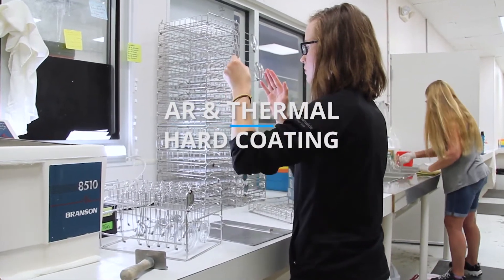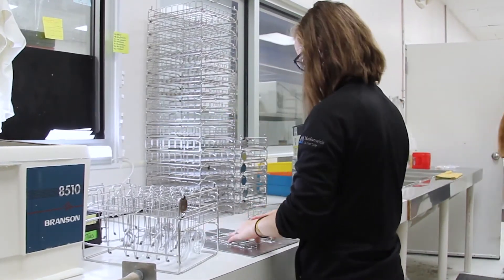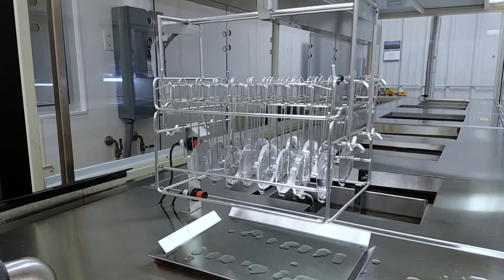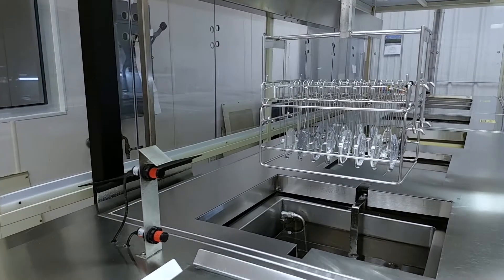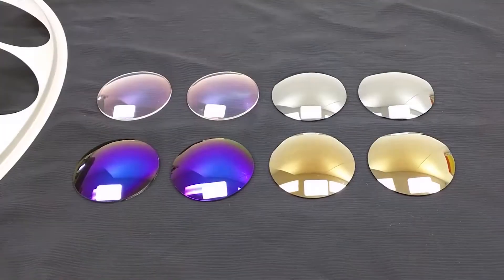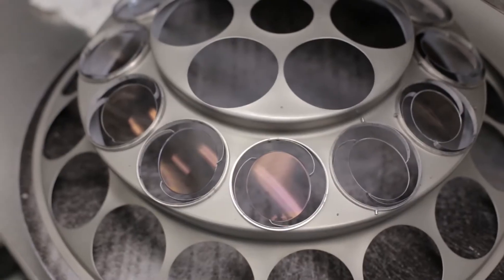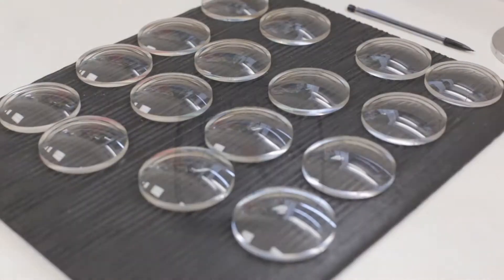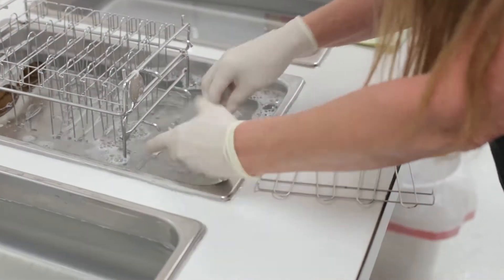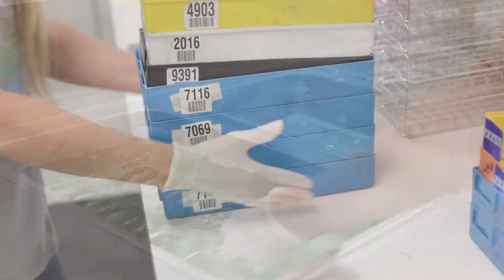The coating lab is a free-standing room within the lab that is operated much like a clean room or operating room. Here, Laramy-K applies anti-reflective or AR coatings, flash mirror coatings, and selective blue blocking coatings too. Start to finish under the best of circumstances, the application process for a premium AR takes roughly five hours to complete.